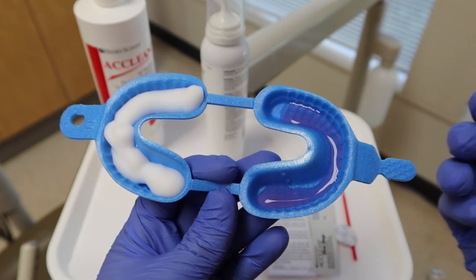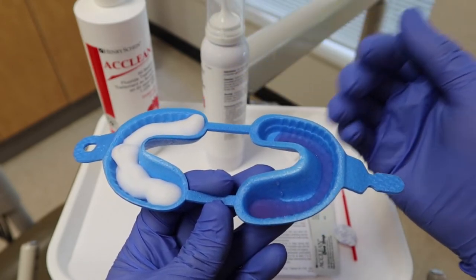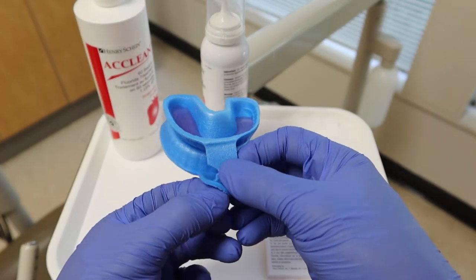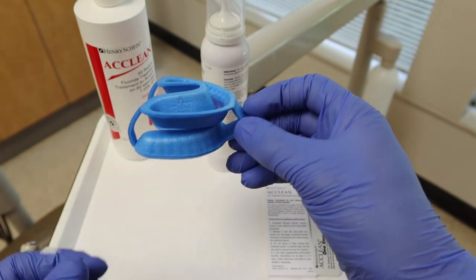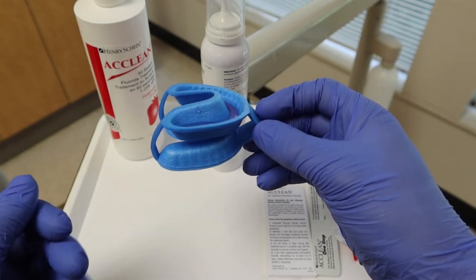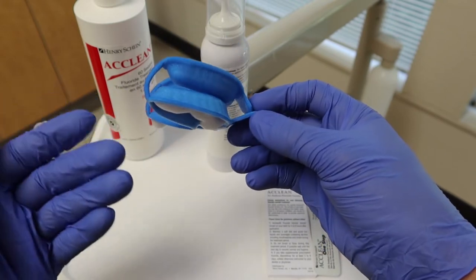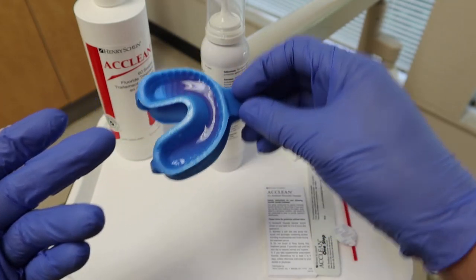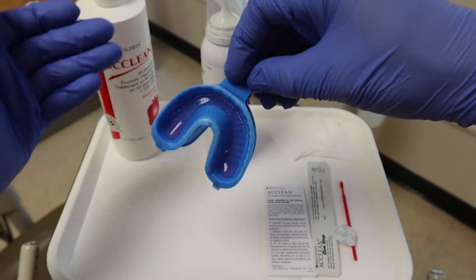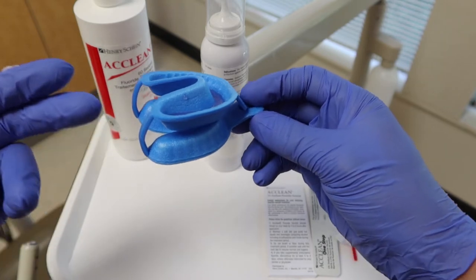What tends to be your preferred way when it comes to fluoride treatment on your patients? For myself, I tend to like the foam — it's a little bit easier to clean up and a little more in control than our gel. Just fold them together and link up this little piece so it holds its position. You'll notice there may be a risk of our materials wanting to run out of our tray. But nothing's running out on the foam side — it tends to stay in the same spot and hold its position, unlike our gel, which will want to be really runny. Apart from that, if you gel up both sides, you want to get this into your patient's mouth fairly quickly.